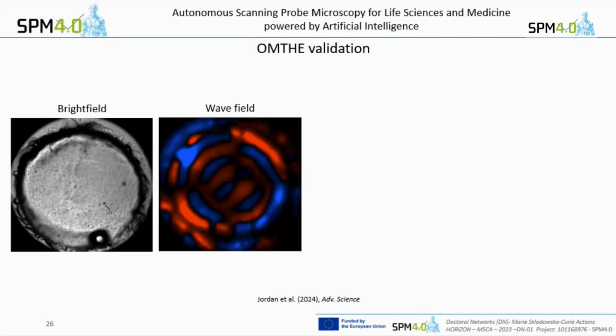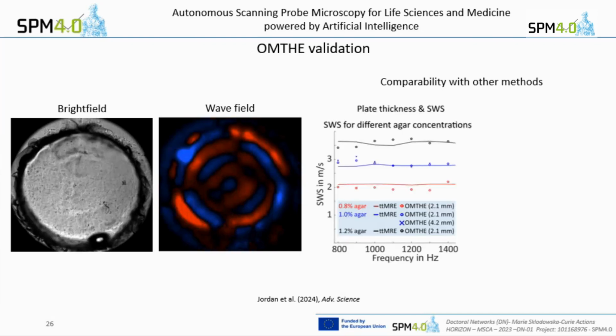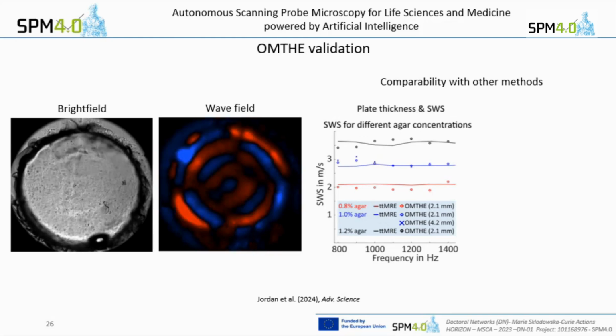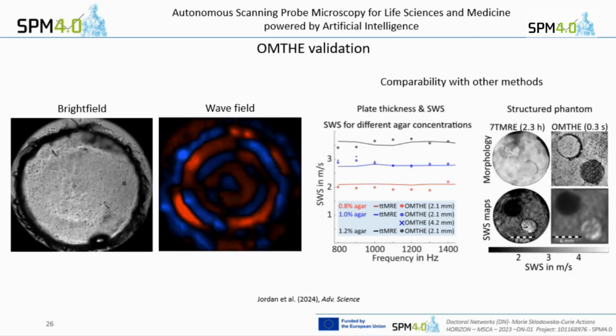Since it uses most of the sample excitation, data acquisition, and data evaluation routines we also use in MRE or ultrasound elastography, it's very comparable with our other methods. You can see dots is OMTE, lines is tabletop MRE, they match really well. You can also see spatially resolved structured phantoms. This is 7 Tesla, this is OMTE, they look pretty much the same. This one takes almost 2.5 hours, this less than a second.